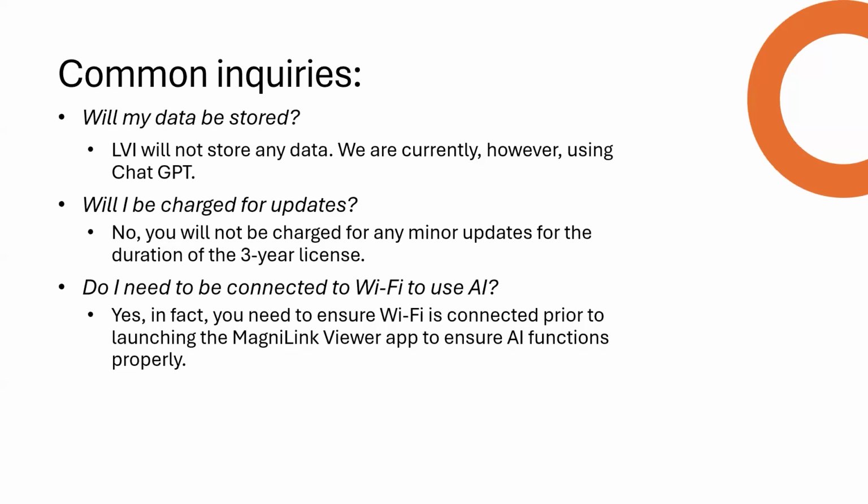Yes, you do. In fact, you need to ensure that you turn your Wi-Fi on, make sure that your iPad's connected. Before you launch the MagniLink Viewer app, you go ahead and launch the app. If you have paid for or you're using the free version for the 14 days, you're going to get an icon at the bottom of the screen that says AI.